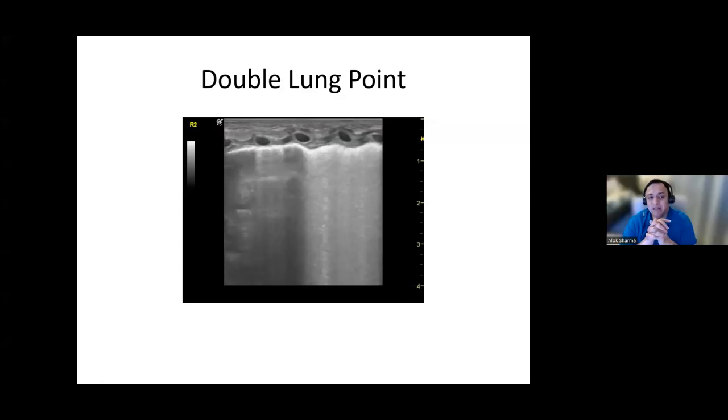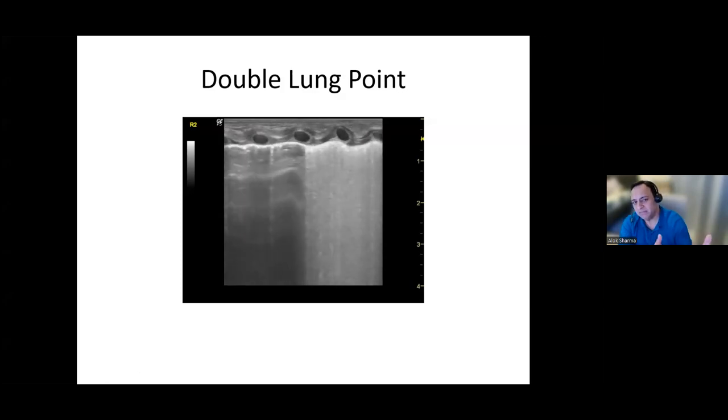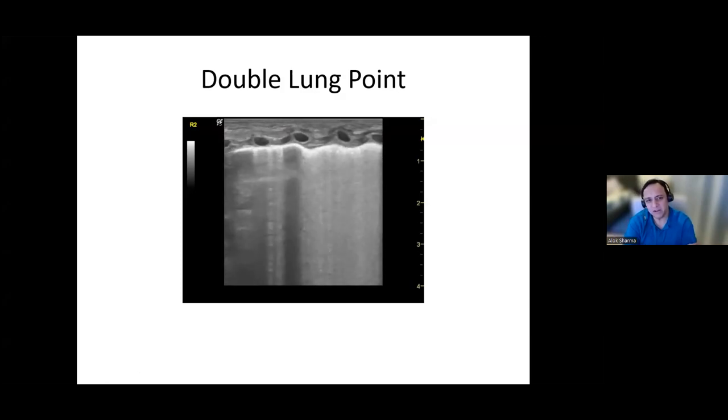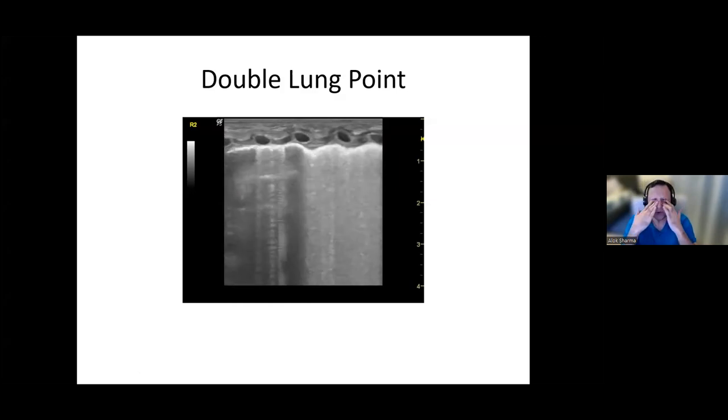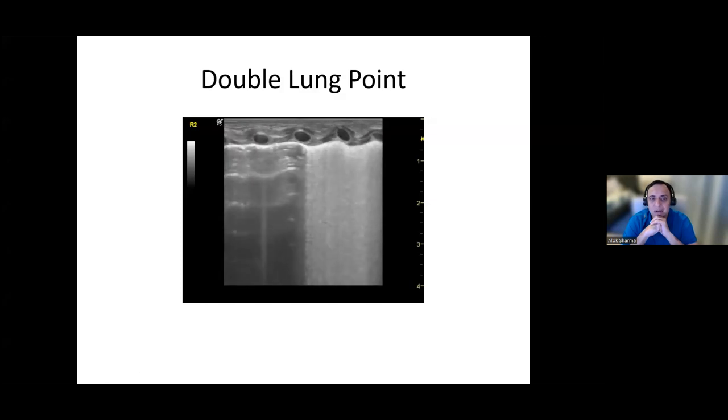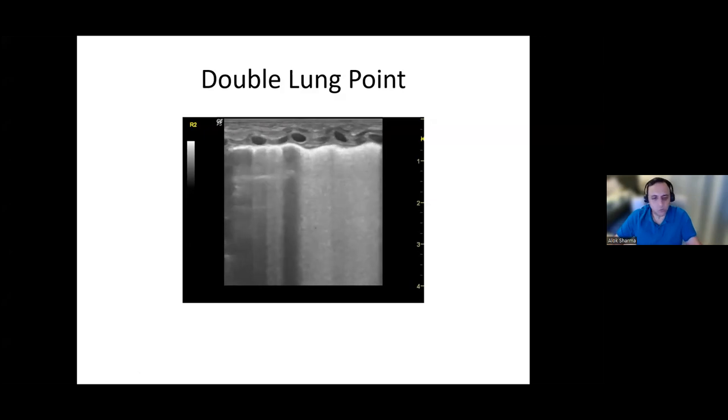Yeah, the reason being, you're assuming that you're looking at R1 and R2. Now, R1 might be fully aerated, and we know that the upper anterior parts of the lungs tend to aerate better. But if you read most studies that have been done and described, there's a very nice paper, which is part of the library, which talks about transition of the lung. The lower anterior regions of the lung in the supine position tend to aerate later on. So this would not be unusual. This is, in fact, fairly typical of a double lung point and where you'd see it.